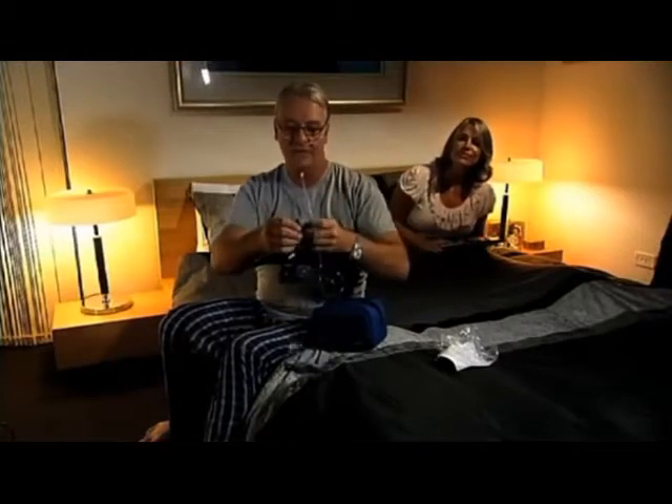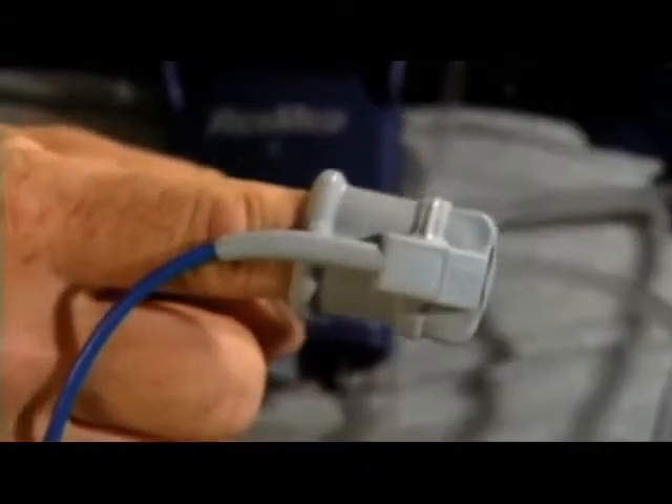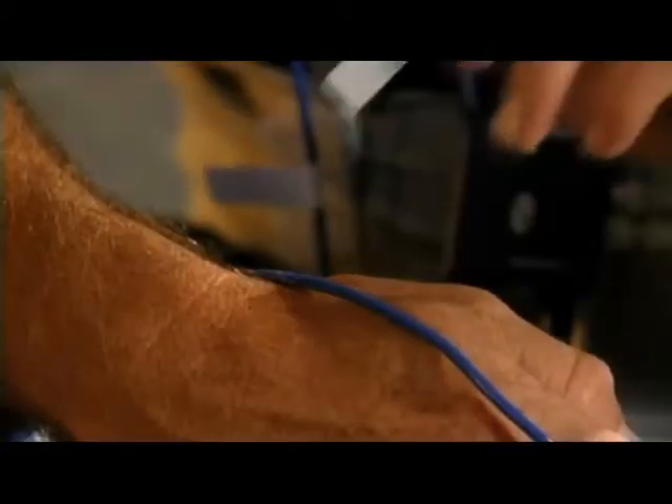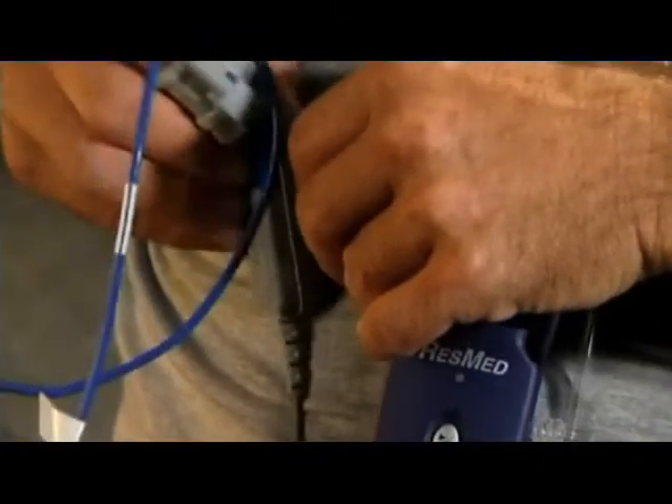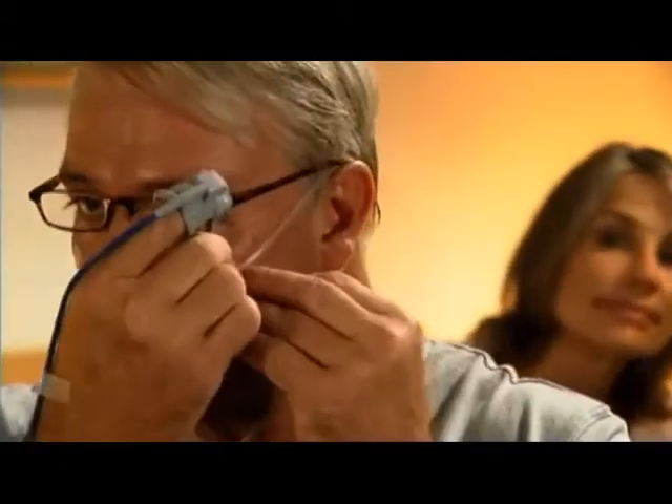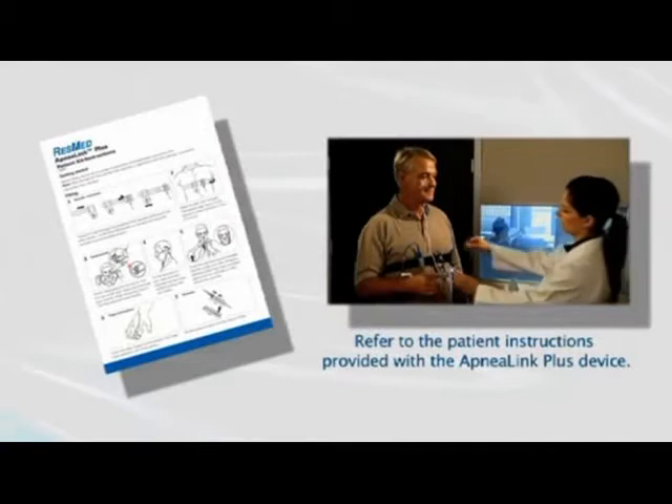The one remaining task is to attach the pulse oximeter device. Place the index finger of either hand in the sensor and secure the line using the tape supplied. If your health care provider has provided you with a different oximeter sensor, please follow their instructions. You can then attach the oximeter to the belt alongside the ApneaLink Plus recorder. If you're an active sleeper, you can also tape the nasal cannula tubes to your cheeks. The system is now fully assembled and ready to start recording.